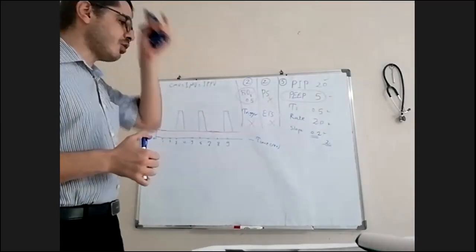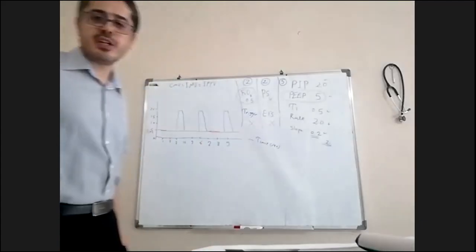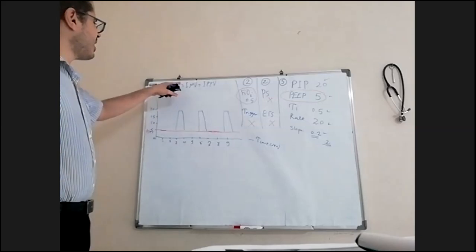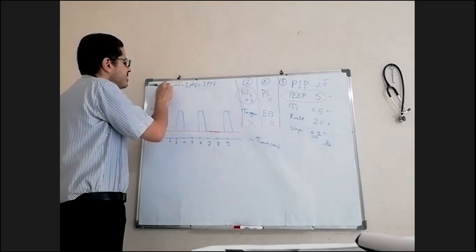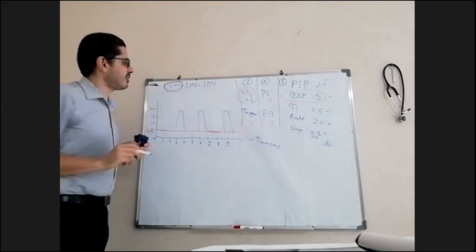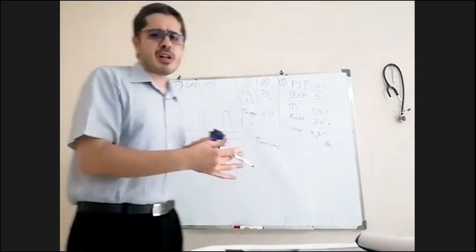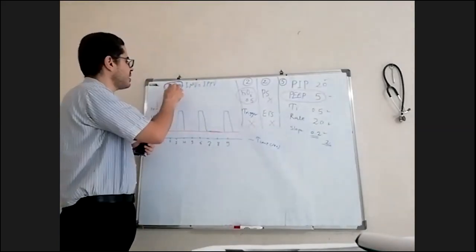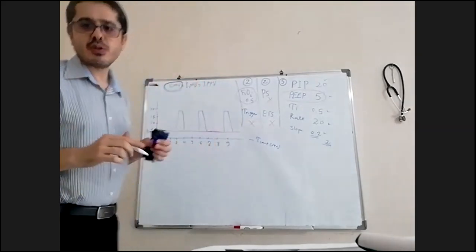So this one is used only if the patient is sedated and paralyzed, like some patients with head injury. It is not used anymore now. Again, if you go to the machines, you may find CMV is different. Some people use the term CMV similar to SIMV. But in the basic, when you say CMV, it is IMV, it is IPPV, the mode which has no relation to the patient.